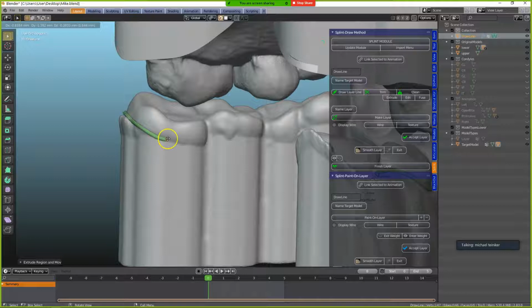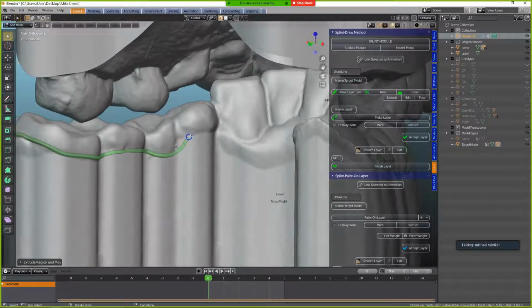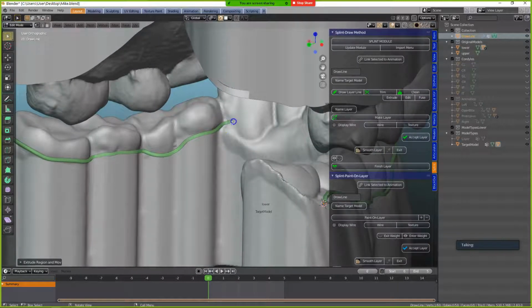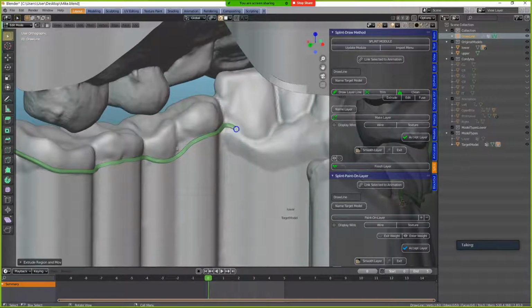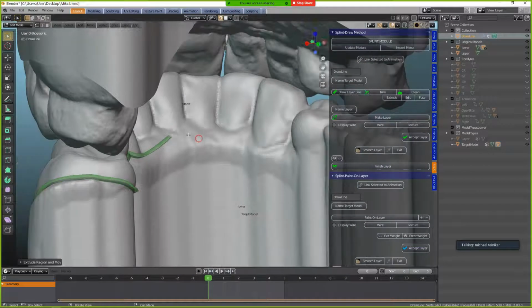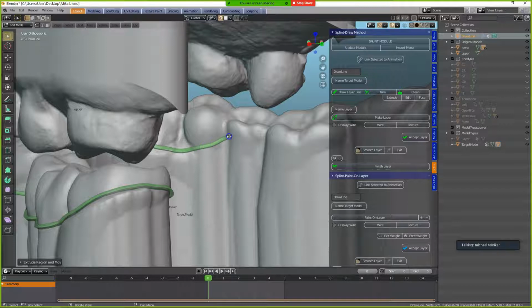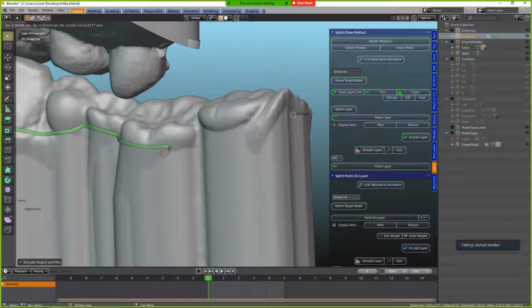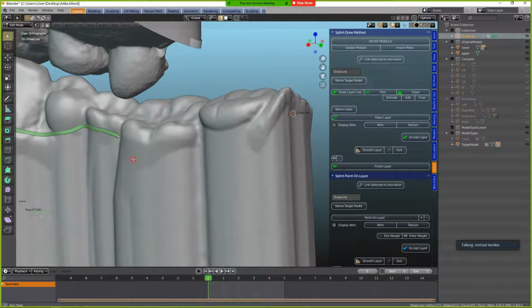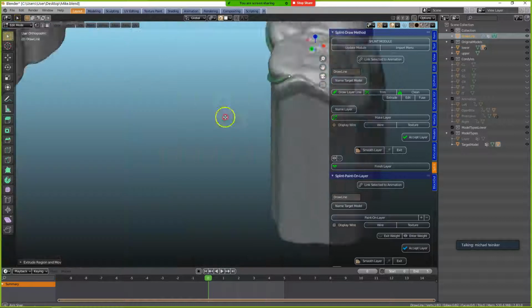Here again, we can see where the undercut is. I'm going to just follow that line. Okay. And up here like that. Maybe we can come down a bit here. And the other thing we always have to make sure is that we save our work. Otherwise something could go wrong, and then all that hard work is lost. Exactly. So, okay, we've got it like this.